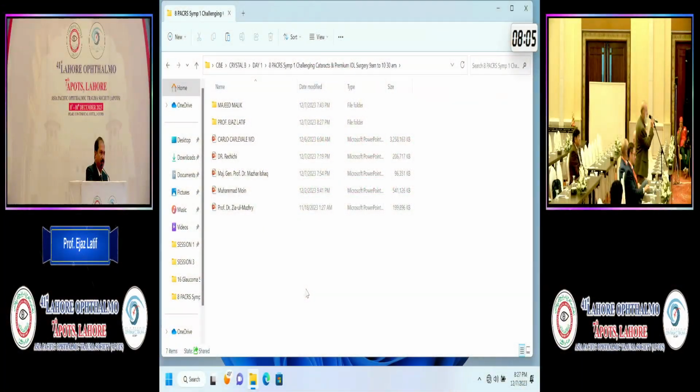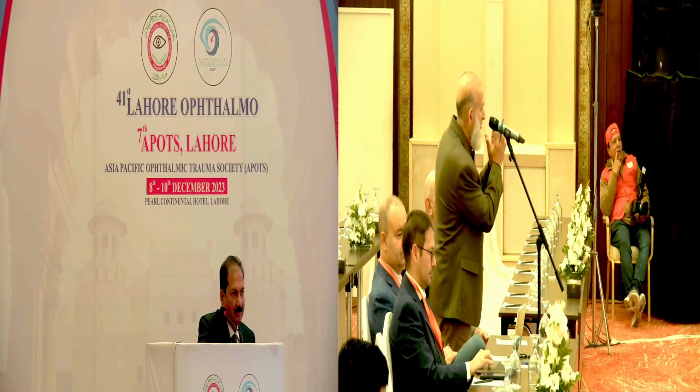The important take-home message is we have patients in our own profession, doctors, and the doctor has been told that you have a special cataract, there can be a gap in the posterior capsule. He is a professor of cardiology at the moment. Once we did one eye, the capsule remained intact. And when he came after a few months with the second eye, we saw him on the slit lamp and could see the posterior capsule split.